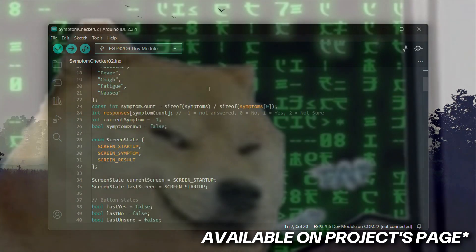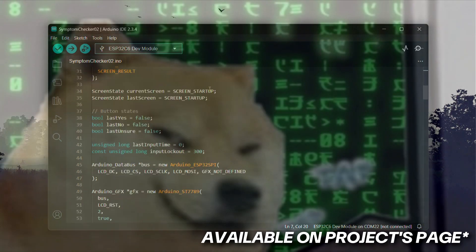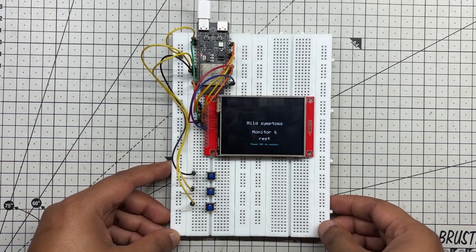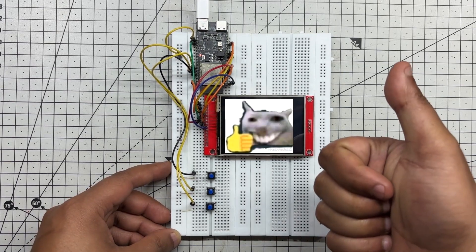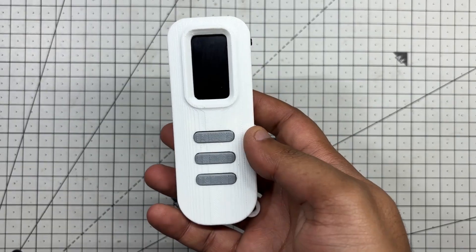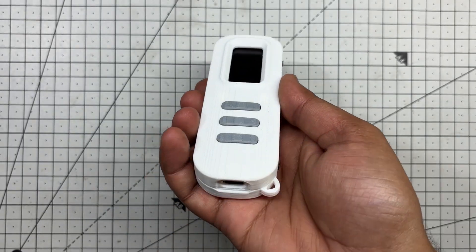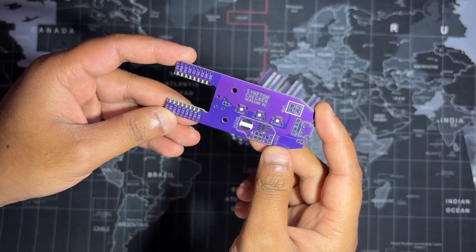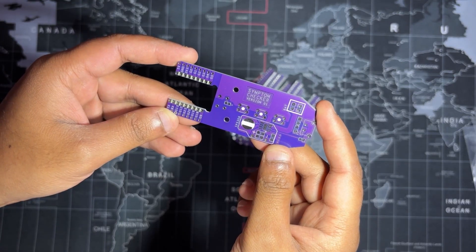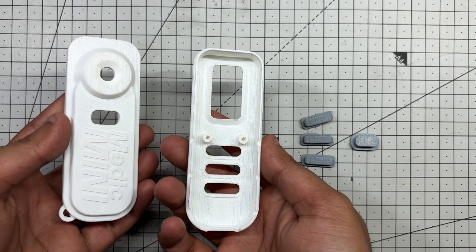This is the test code that we use in this project. Once everything is working reliably, the plan was to shrink the entire system into a compact handheld device using a custom PCB and a 3D printed enclosure.